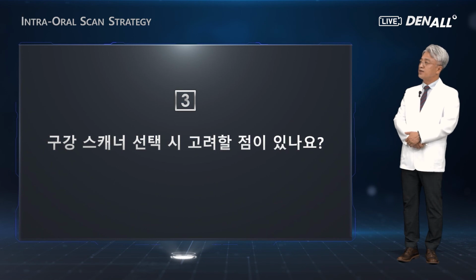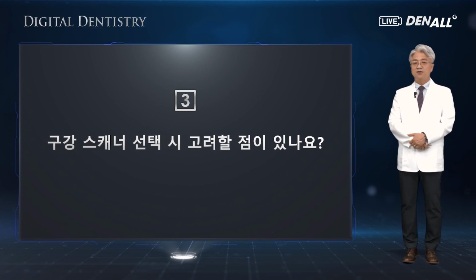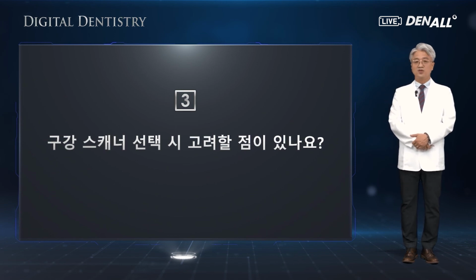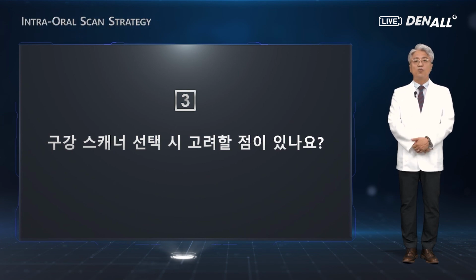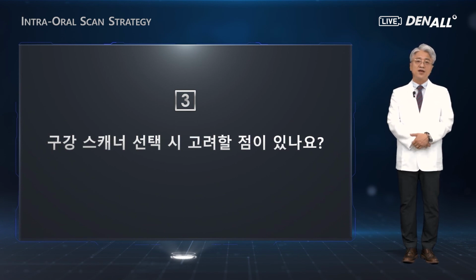The third question, what needs to be considered when choosing an intraoral scanner? In choosing a scanner, I believe many dentists would know about that already. Before I talk about it, one of the roles of the scanner is to acquire very precise data from a patient. Therefore, the precision of a scanner is the most important thing.